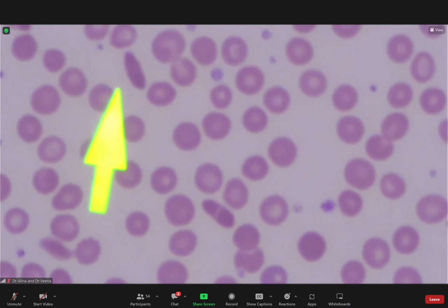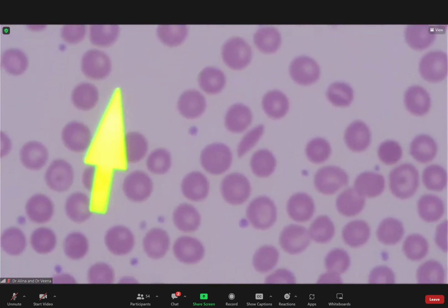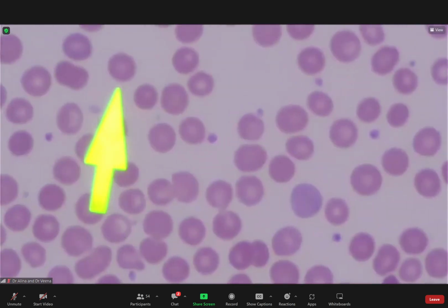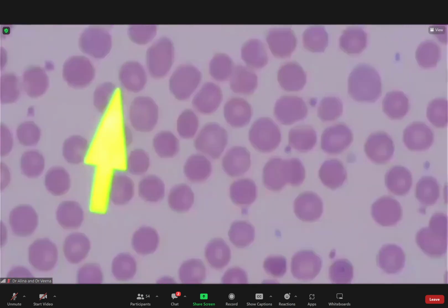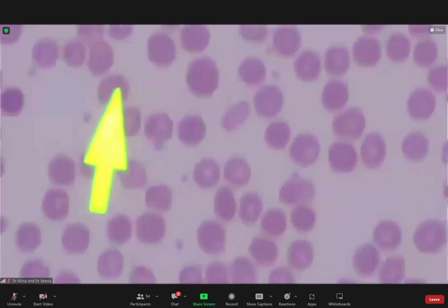Especially for MFAT, don't expect to get sickle cells at 30%. Yes, in your exam, these are the things that they will test. Not so florid, not so in your face, but it's there.